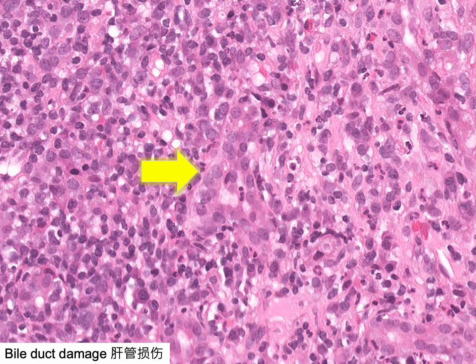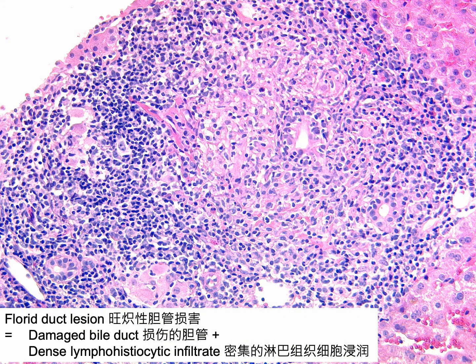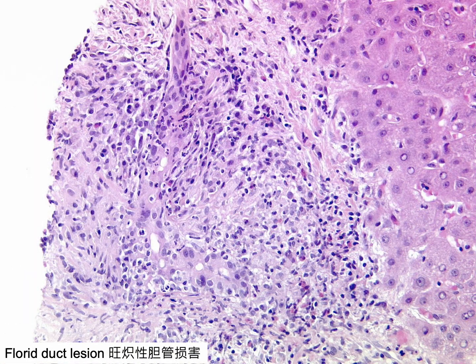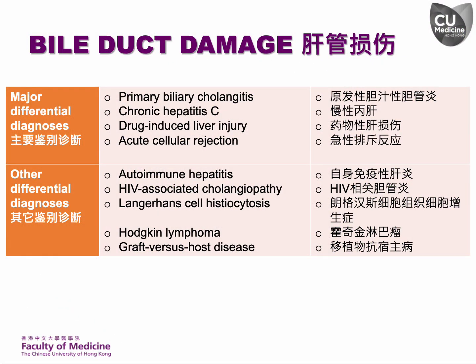An interlobular bile duct infiltrated by inflammatory cells shows varying degrees of epithelial disarray. A florid duct lesion is a damaged interlobular bile duct surrounded by dense lymphohistiocytic infiltrate and is a characteristic feature of primary biliary cholangitis (PBC). Damage of interlobular bile ducts is mainly caused by PBC, chronic hepatitis C, drug-induced liver injury, and acute cellular rejection of the liver allograft.